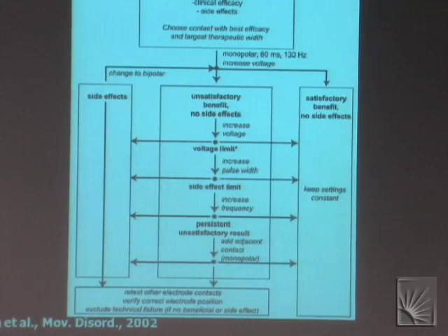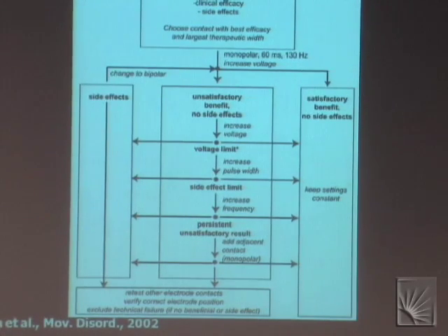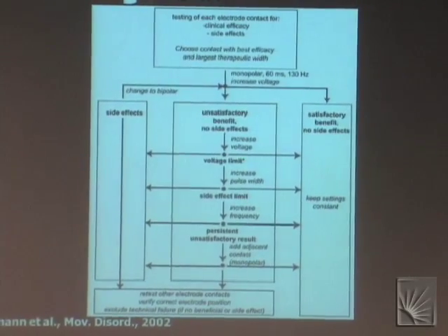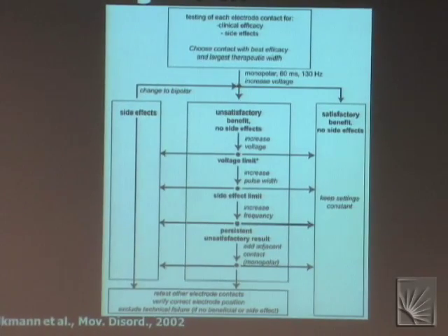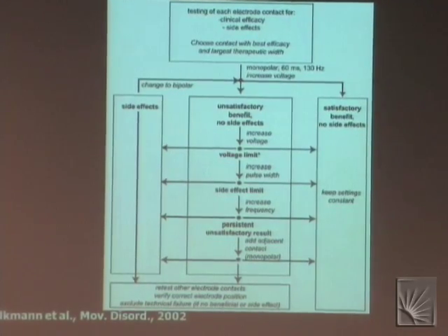The concept is that once the DBS electrodes are implanted and the patient's sewn up, a few weeks later they will return back to the clinic, and now they are the neurologist's patient, and the neurologist and their clinical staff are responsible for selecting the stimulation parameter settings for that patient.